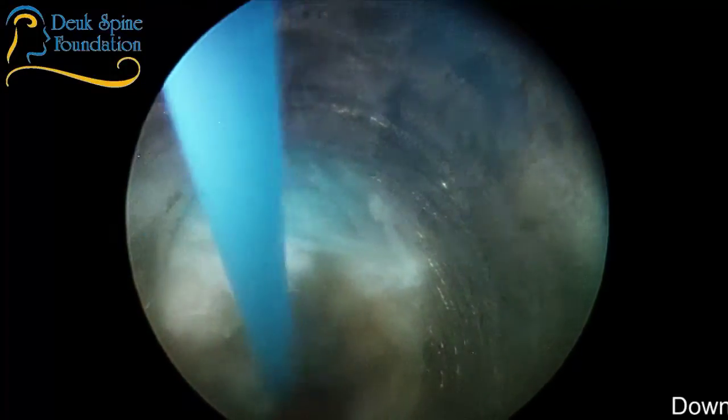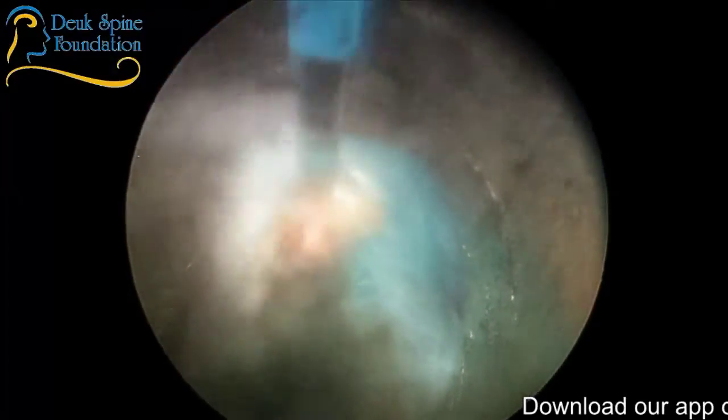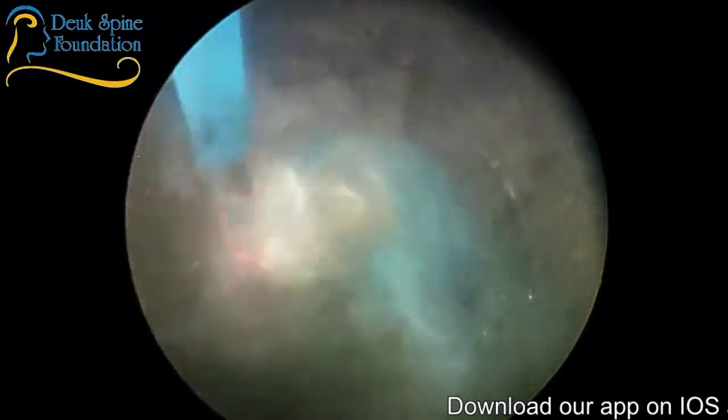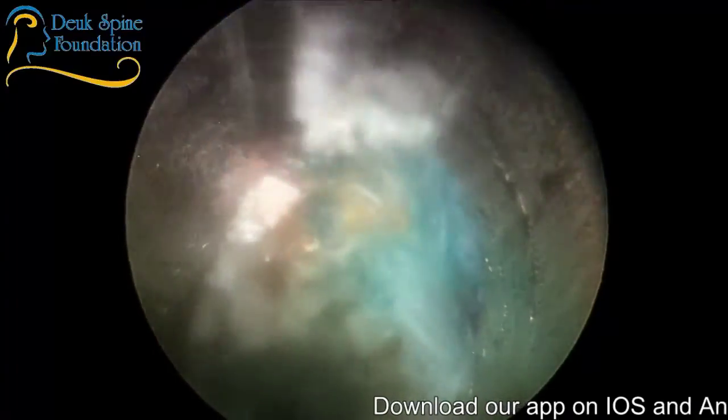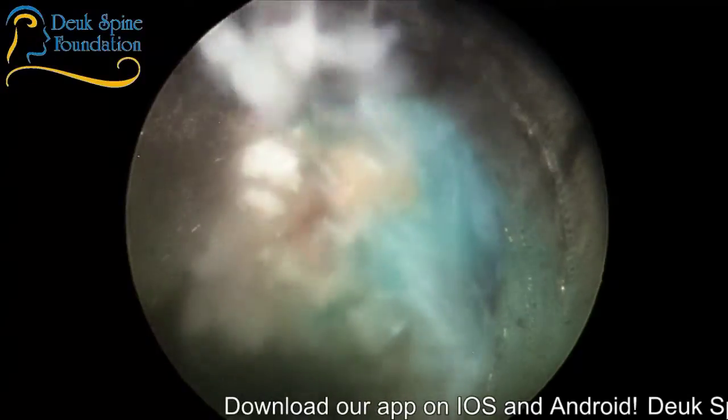Okay, so we're just about done with the L5S1. You can see the epidural space, the epidural fat. This is a calcium, a bone spur right here, for those of you wondering. That gold thing right there was a bone spur. I zapped the heck out of it.